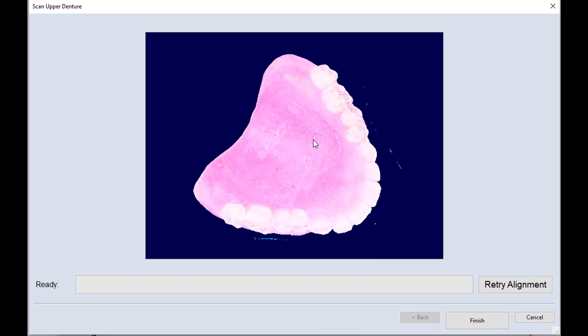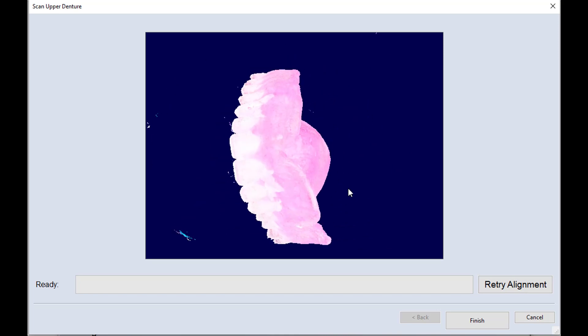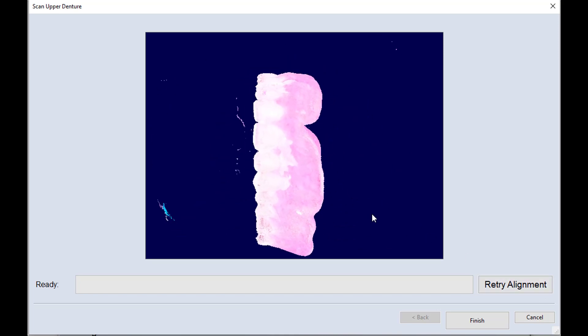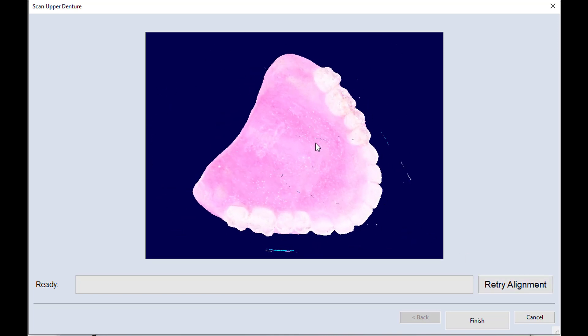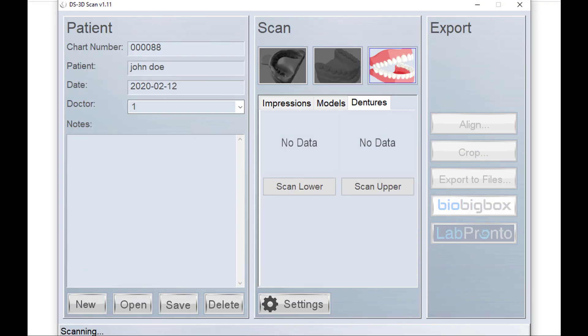So we finished this. If for whatever reason it did not align, you could hit the retry alignment, but I've not had this fail just yet. So I'm going to click finish.